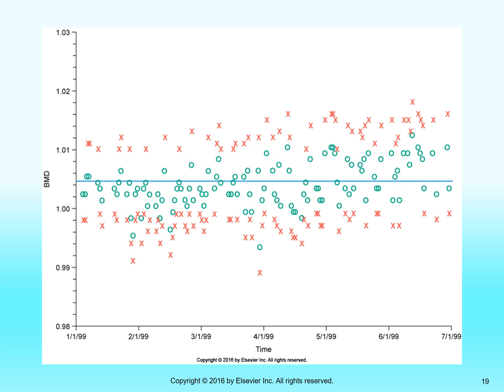The green data set and the red data set both deliver the same average, which is represented by the blue line. But the red data set has twice the standard deviation of the green data set. And so the percent CV is smaller for the green data set. And you would say, if this was two different machines, the data acquired by the green machine, the green circles, is from a better bone densitometry machine than the data acquired by the red machine.